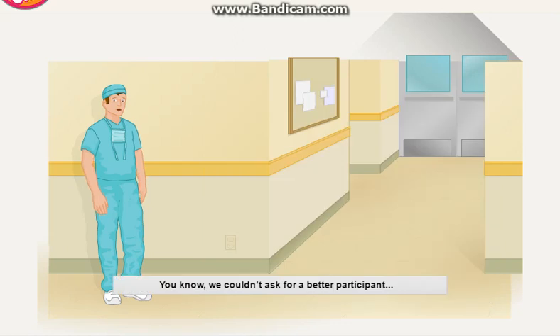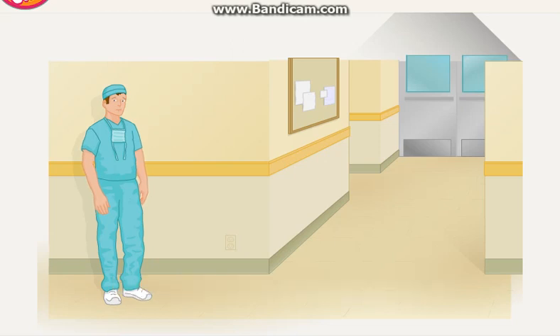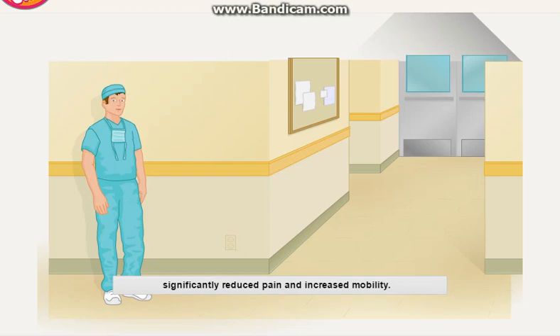You know, we couldn't ask for a better participant. You've done an excellent job. Are you sure this is your first total knee replacement? Our patient will remain in the hospital for 3 days, followed by 3 to 8 weeks of physical therapy. Because of this surgery, our patient will have significantly reduced pain and increased mobility.